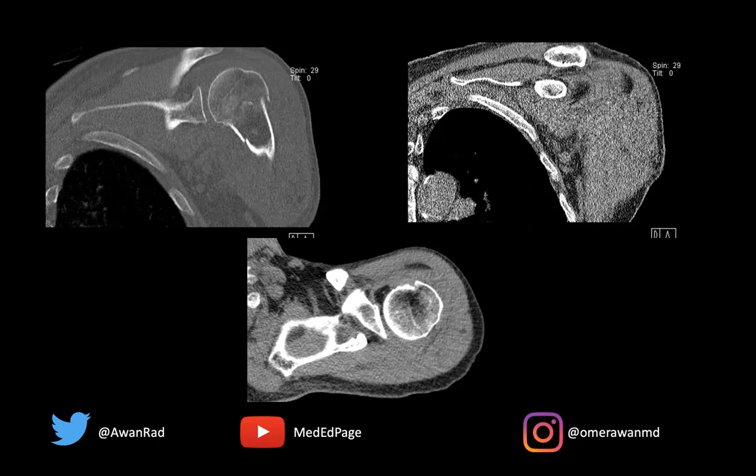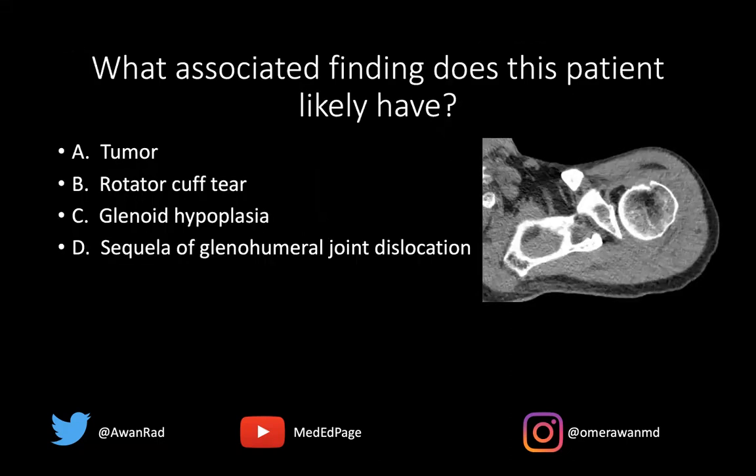We have coronal images and soft tissue window images through the shoulder, and we have an axial image in soft tissue windows through the shoulder. The question I have for you is: what associated finding does this patient likely have? Does this patient have a tumor, a rotator cuff tear, glenoid hypoplasia, or sequela of glenohumeral joint dislocation?